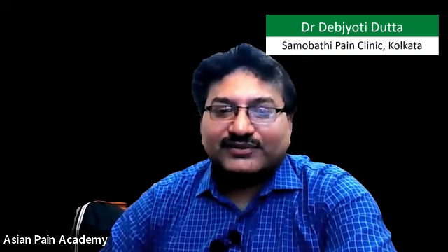Next topic is the sacroiliac joint, and in reality, today most of the sacroiliac joint procedures in most centers have already been replaced by ultrasound. The success rate of ultrasound there is quite good, and it is easy, it is cheap, and it is possible at the bedside. So all the advantages of ultrasound are there in the case of sacroiliac joint interventions.